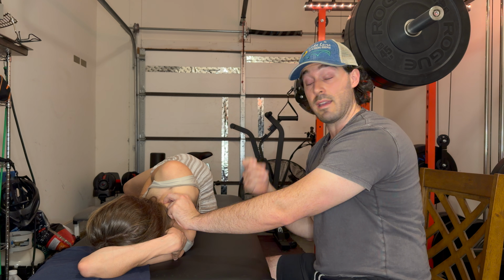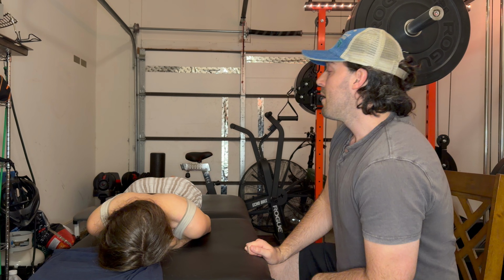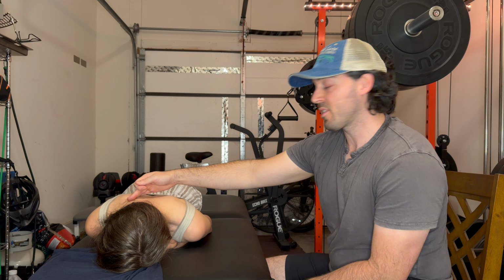That's actually really safe. If my patient will lie down on their stomach next, I'll show you my other approach that I like to do for the levator scapula. This next approach utilizes a different position of the shoulder blade entirely, just so that we can bias the more medial superior border of the scapula.